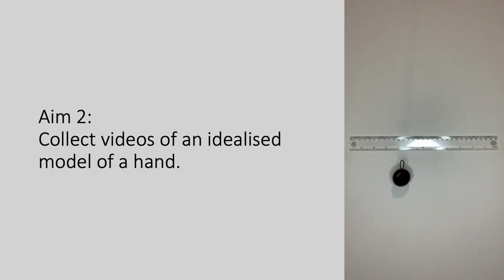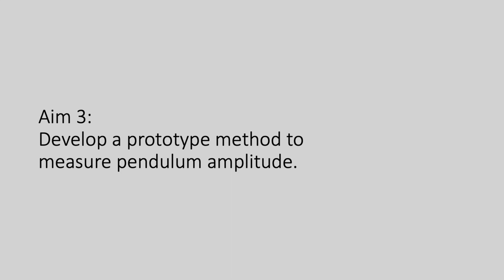However, before collecting videos of hand tremors, I recorded a set of videos of an idealized model of a hand, that being an oscillating pendulum. I did this so that I could write a prototype method which measures the movement of a simple object before increasing the complexity of the problem with the introduction of hand detection. Pendulums move in a simple and repetitive manner, making them a good simple model of a tremoring hand.